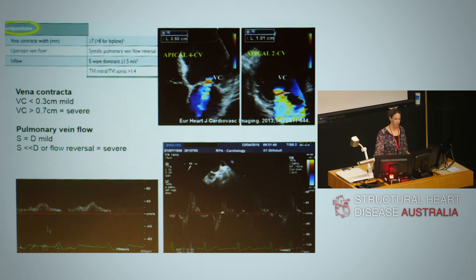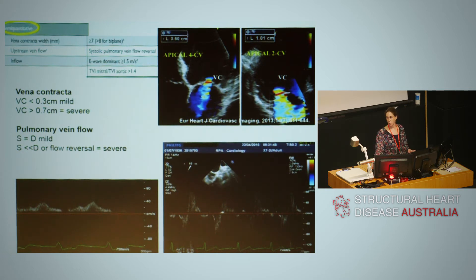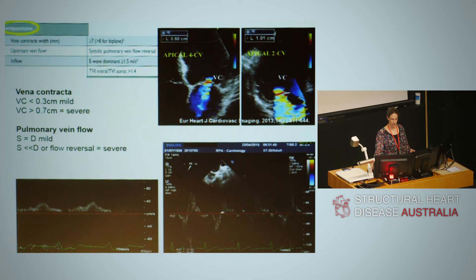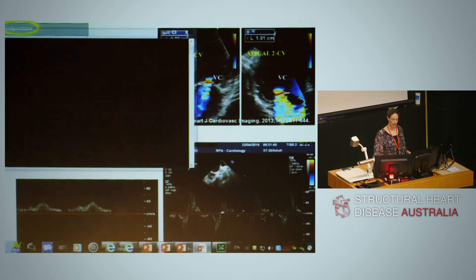Semi-quantitatively, we can also assess pulmonary venous flow. Normally, the systolic component is greater than diastolic. As mitral regurgitation becomes more severe, systolic flow decreases until in severe MR we have systolic flow reversal. This is often better seen on transesophageal imaging, shown in the right-hand panel.